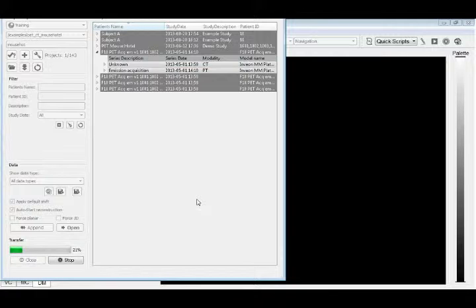Now you see the transfer with on-the-fly compression, but it still takes a bit. Well, this is a big one. The images won't really matter for what I'm doing. It's really just drawing spheres, but VivoQuant caches images in the local cache for a while, so once you have open data sets, the next time you request them, it will be much faster, and then you can set a certain cache size, and then all the files get removed. Speed things up further.